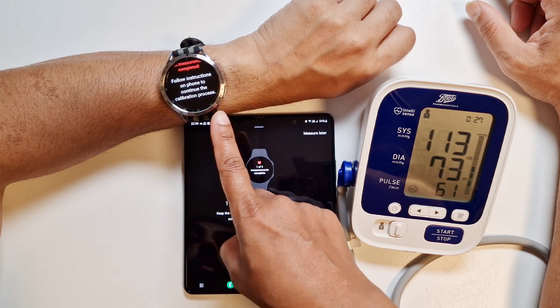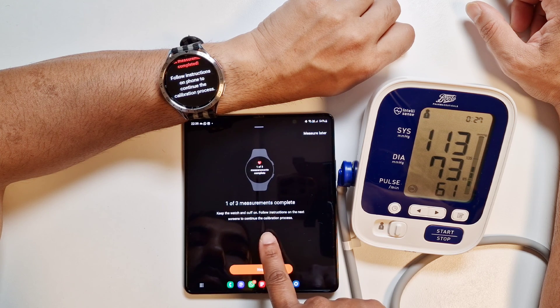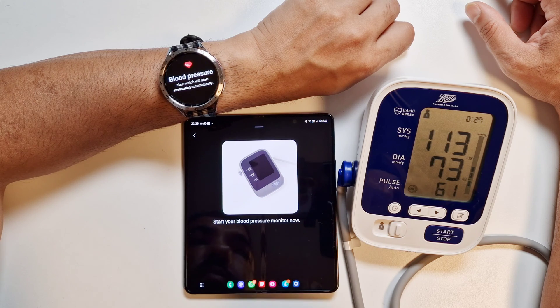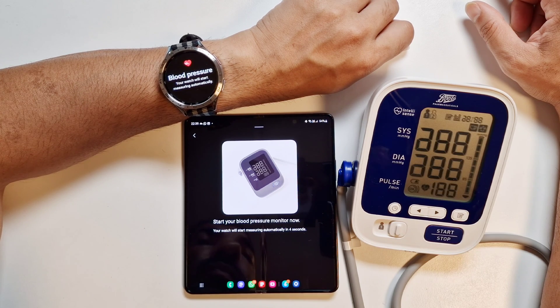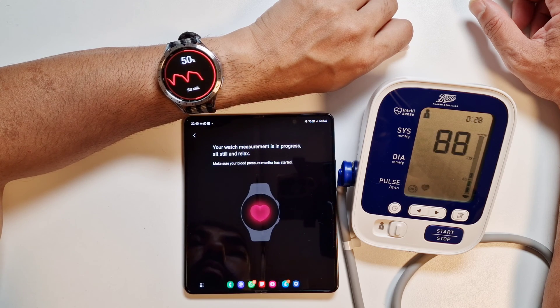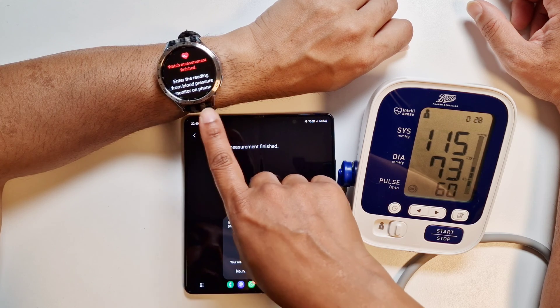That's the first of three measurements completed. Keep the watch and cuff on and follow instructions on the next screen to continue the calibration. Make sure your watch is on your wrist and your cuff is on the opposite arm. Next — start your blood pressure monitor now. The watch is automatically detected and started as well. Again, sit still and relax and make sure you don't talk while taking the measurement.